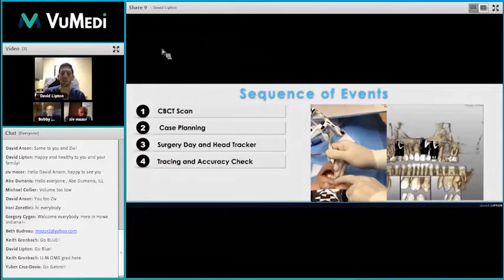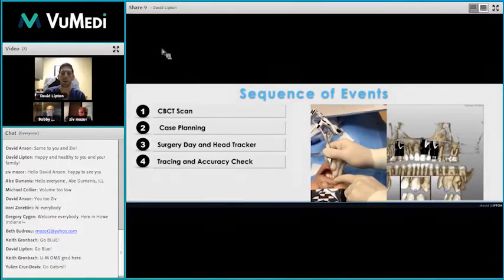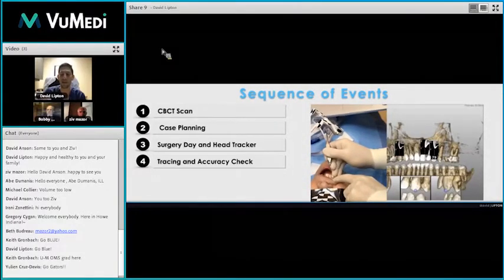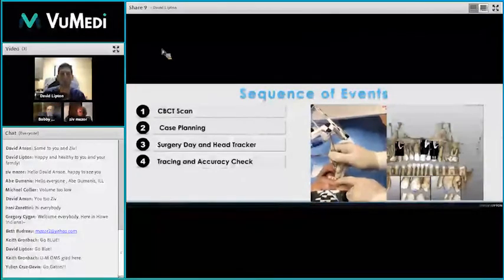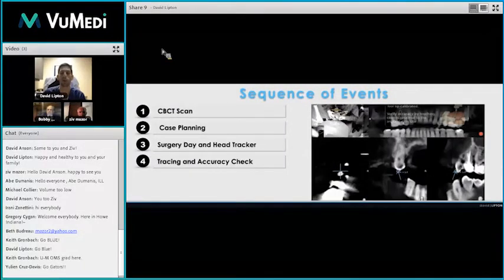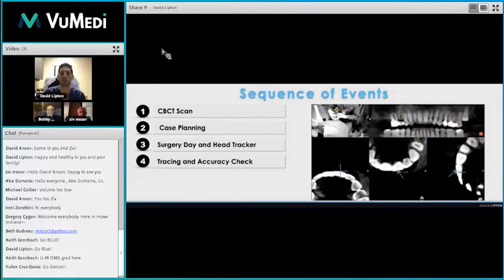And what you're going to do in these cases is select X amount of teeth. You're going to trace them until you get to essentially 100. It's going to bing, and you move on to the next tooth. If for some reason it's not doing it, you're going to choose new teeth and continue going until you've met your criteria. But you need to make sure you trace correctly. So now you're going to perform an accuracy check, and this is what's correlating what you're doing in the mouth to what's going on in the computer through the fiduciary markers as well as the camera.